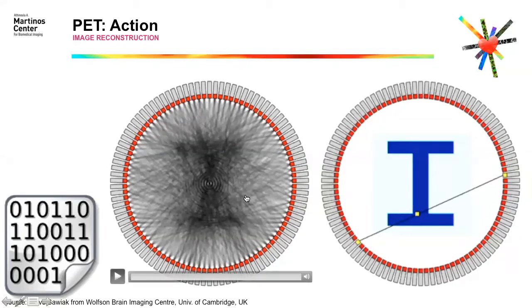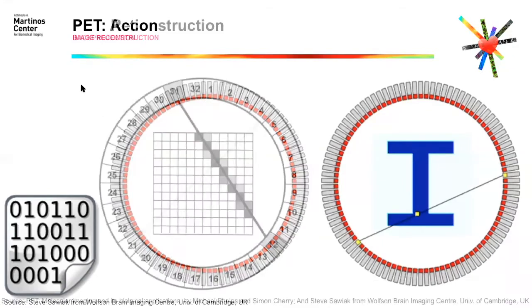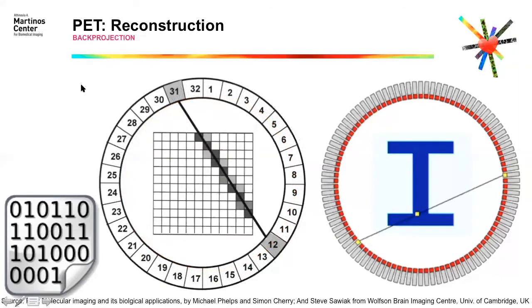But because this image is really horrible, nobody works with this type of images, we do more things behind that. And part of it is, first of all, I'm not going to be assigning to every voxel, which is basically any one of these squares, the same value. A voxel is a 3D version of a pixel. The pixels are the camera elements on your phones. A voxel is the 3D extension of that 2D camera.